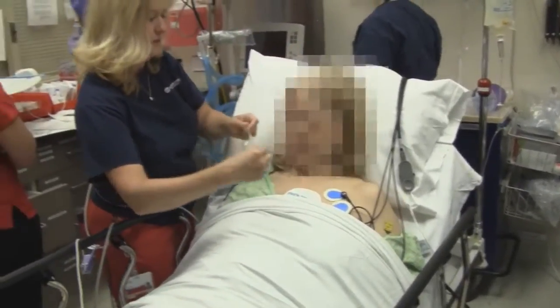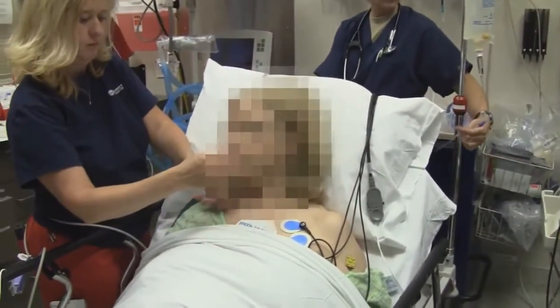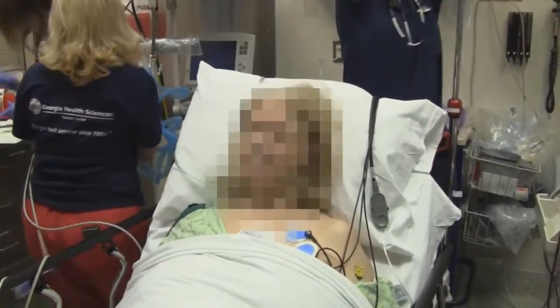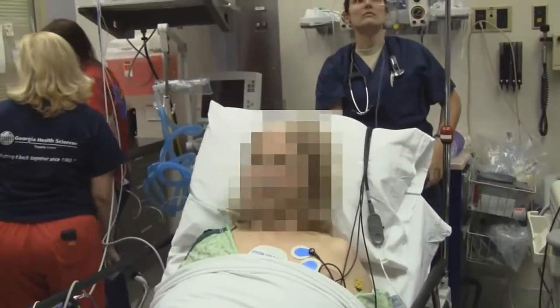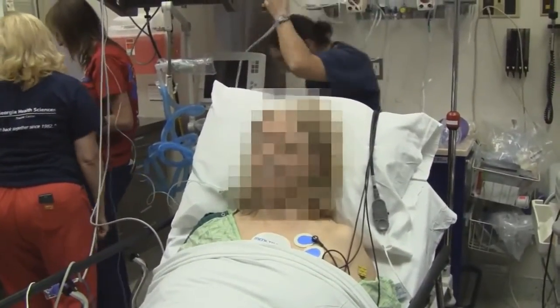When did your heart start beating fast? About 11:15 today. And tomorrow you were actually going to get an ablation procedure — correct. And so you were taking off your medications and waiting for the procedure to be done.